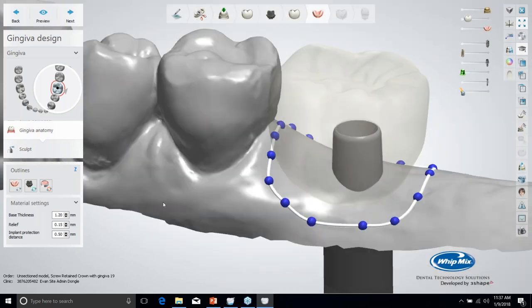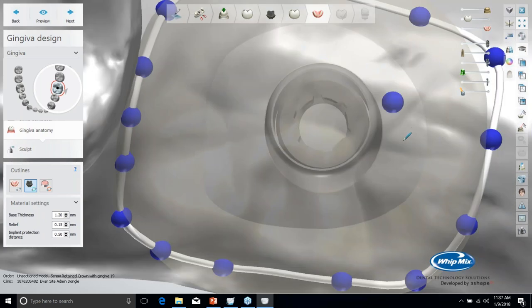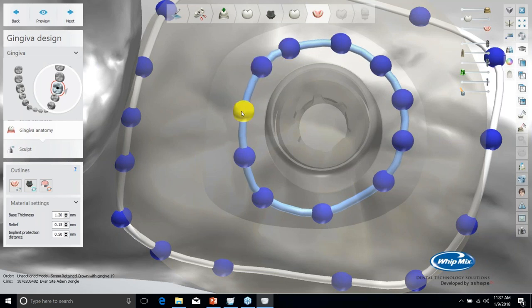I like that. So we'll go ahead. And now we have to draw our window. So I'm going to click that. And you have to put one of these around every implant that you have, but I've just got the one. So again, single left clicking. Finish by clicking the first point, and then just make sure you've got a little bit of space around that implant.